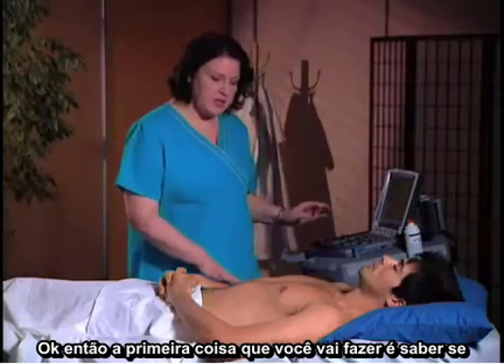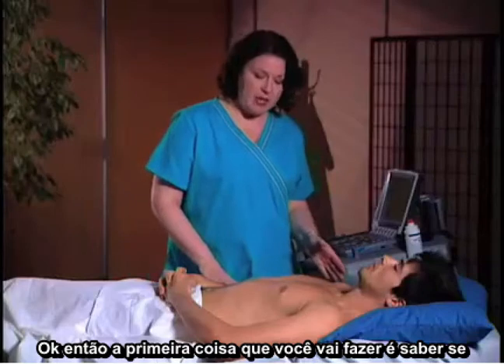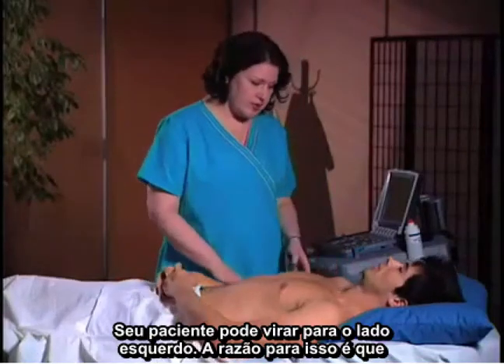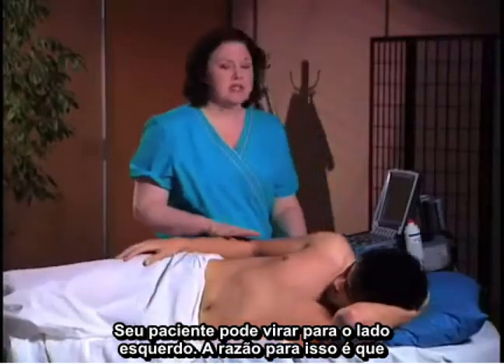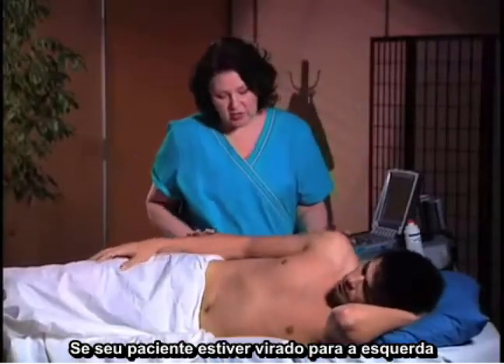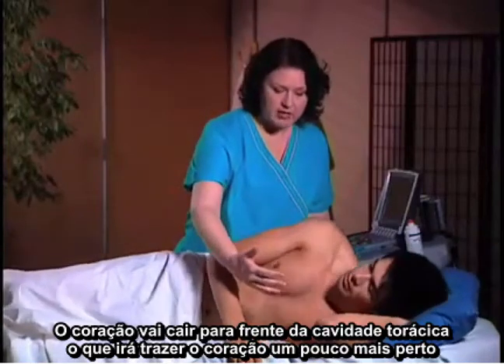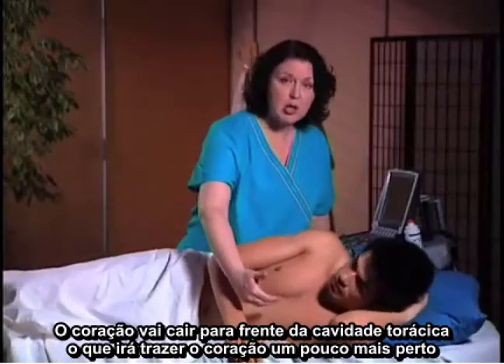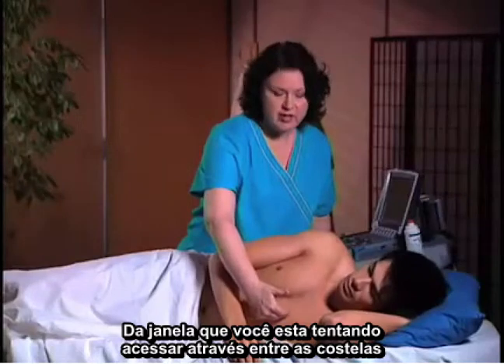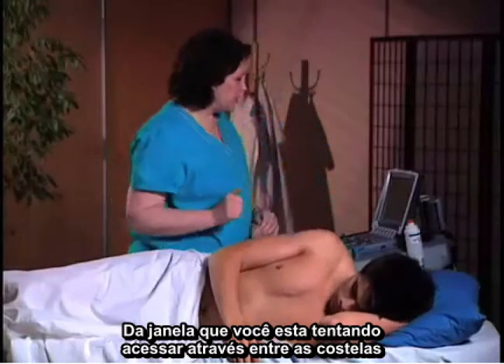The first thing you're going to do, if you can, is have the patient turn over to their left side. The reason we like to do this is as the patient turns to their left, the heart is going to fall forward in the chest cavity and bring it a little bit closer to the window that you're trying to access through the ribs.